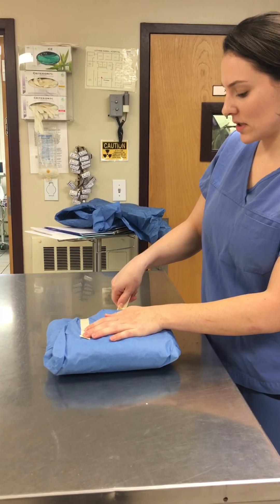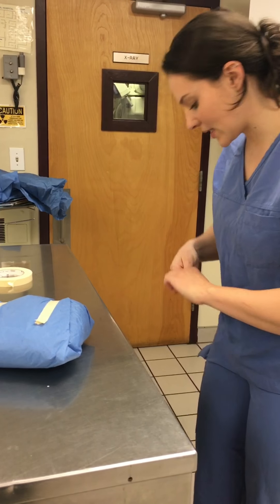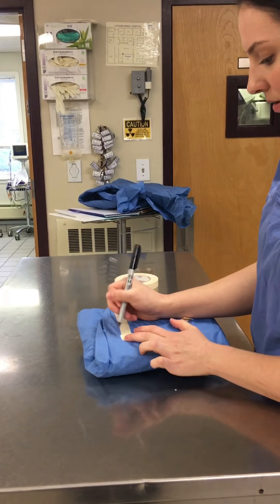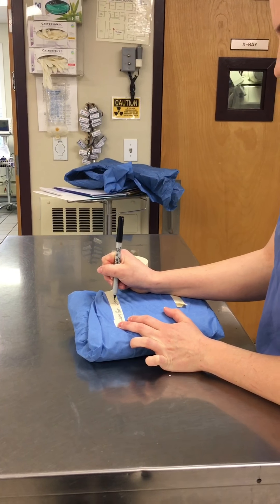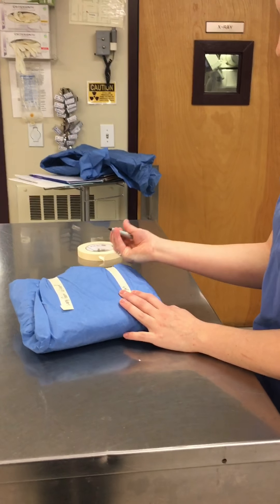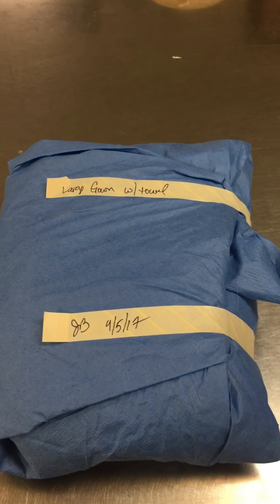And then it needs to be taped with indicator tape. Put two strips on here. I like to create a little flap so that it's easy to pull off. One layer here, and then a second piece of tape here. This is very tightly sealed. And then finally, it needs to be labeled with what is inside of the pack. This was a large gown, with a towel. And then my initials here. The date. And then it's ready to be autoclaved.